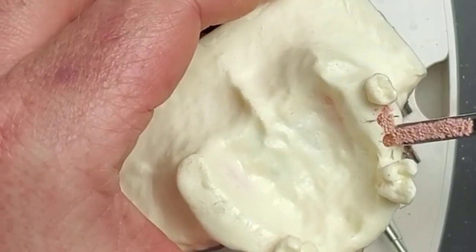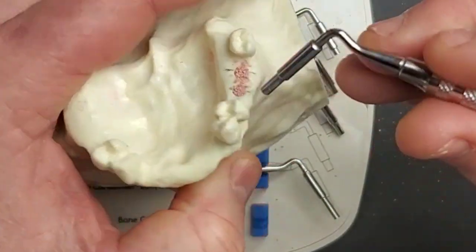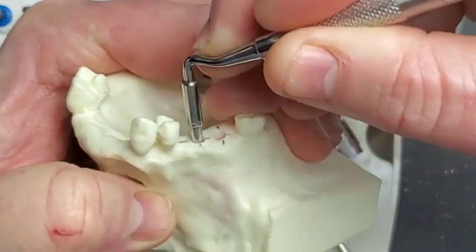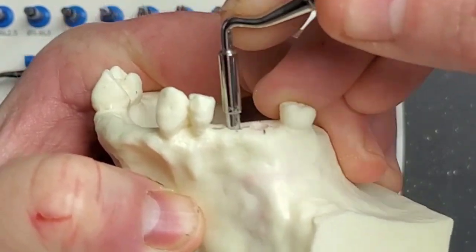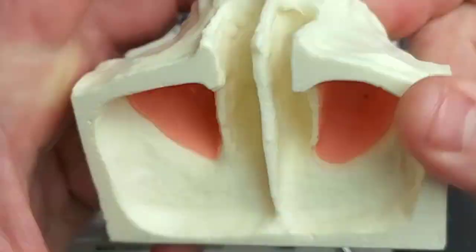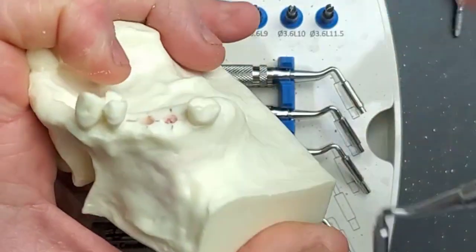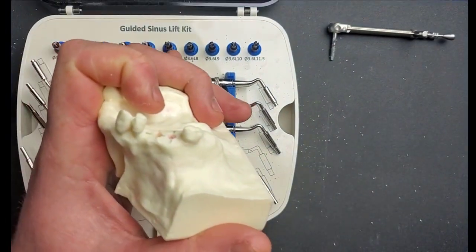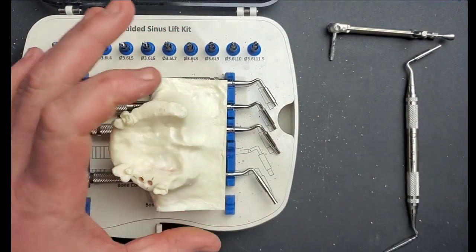I'll take the eight millimeter stopper and begin condensing this graft material. When you do this, you don't want to just jam it in and poke real hard — rather you want to wobble it back and forth. As I'm doing that you can see it seems to be going a little bit deeper but will eventually bottom out on the crest. There's a built-in stopper on this condenser that's going to prevent you from pushing too hard. That lateral wobbling motion ensures the bone gets condensed out laterally — we don't want it all going straight up; we want it to condense out and create a bubble of bone or a little dome.